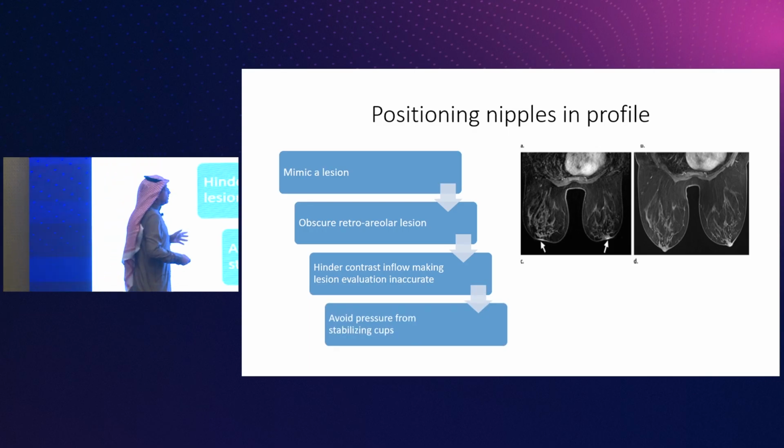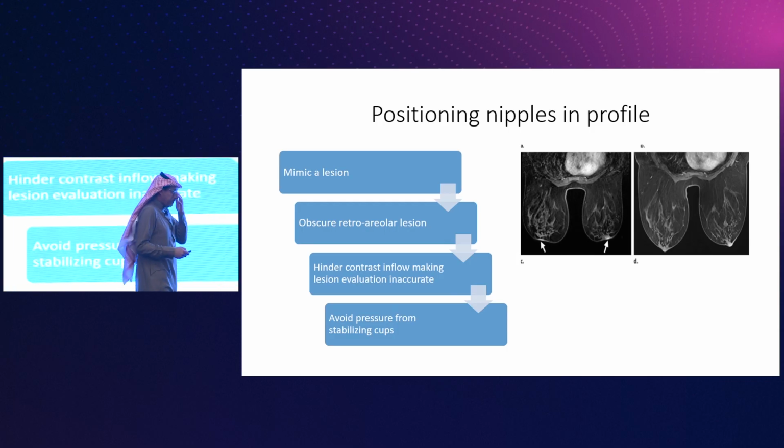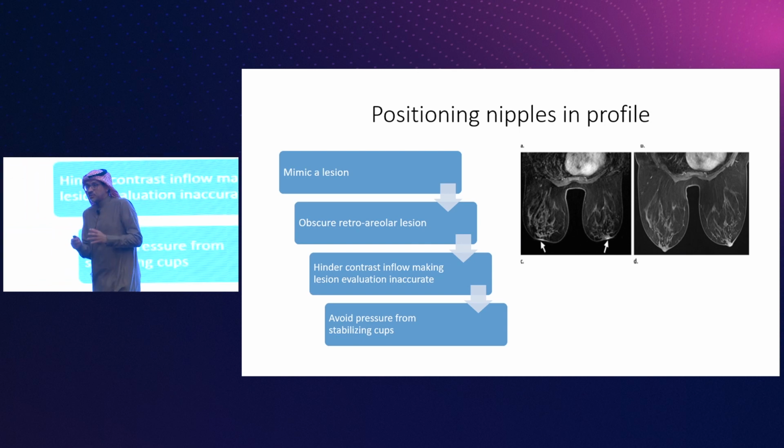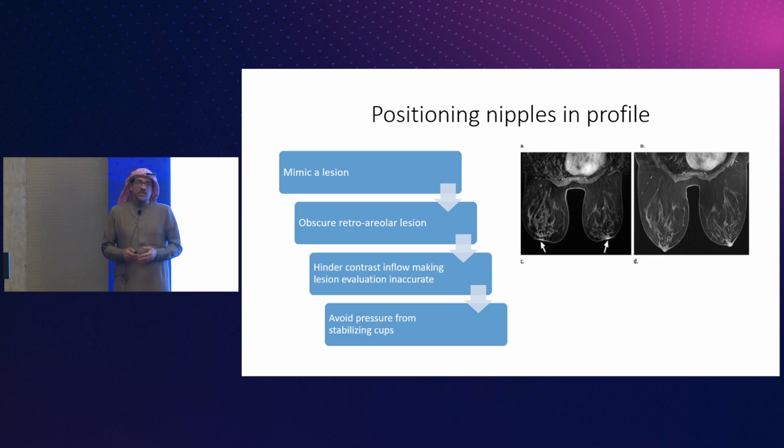And, doing so, okay, if there is a large breast and you need to deal with it, you have two ways. The first one is to put a towel over the coil, and that will elevate the patient a little bit. The second, cup.